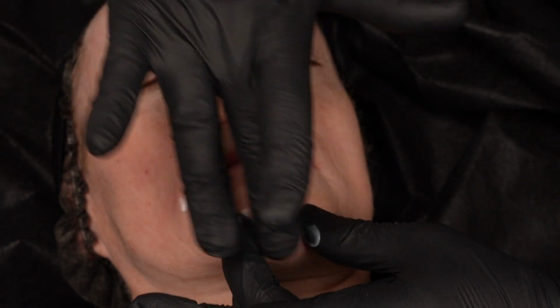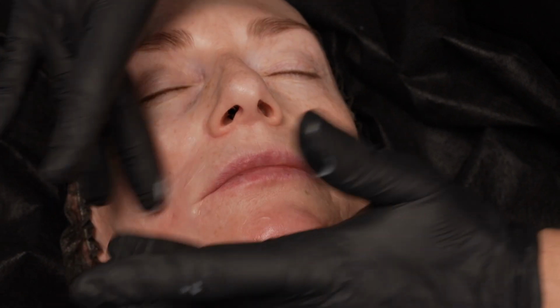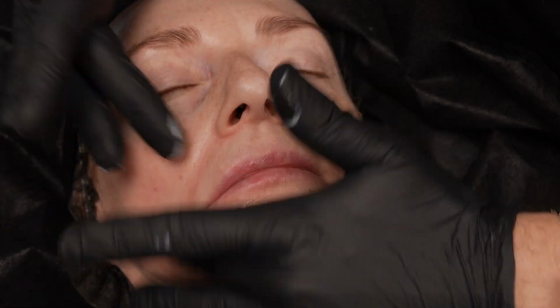And you wanted to show the shape of the lips, right? Or it's later? I think we continue with the other patient. Okay. Look here. What does she need more? I cannot see. Okay, now let me see the fold better. Marionette fold better. Look at this side. Square. It's V shape. Can you see it? It's more visible, less visible. Its mouth, it's up, it's more down. You see?